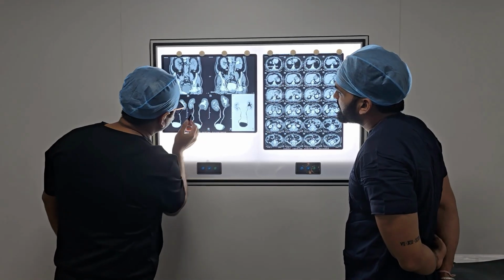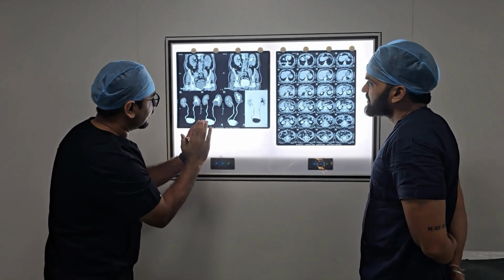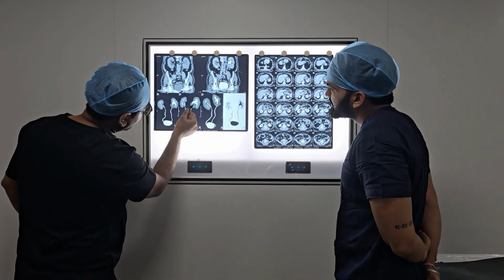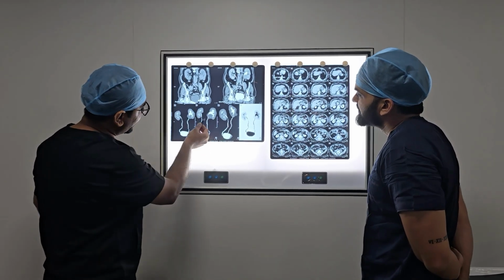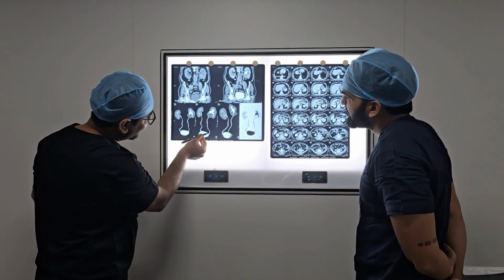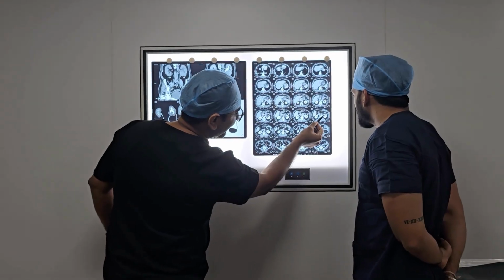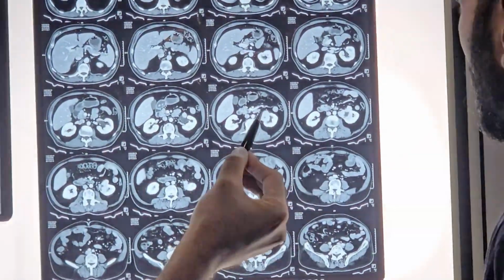It is in a particular configuration such that it is engulfing the upper ureter on the medial border. There is a thin layer of the mass itself covering the upper ureter just after the PU junction.